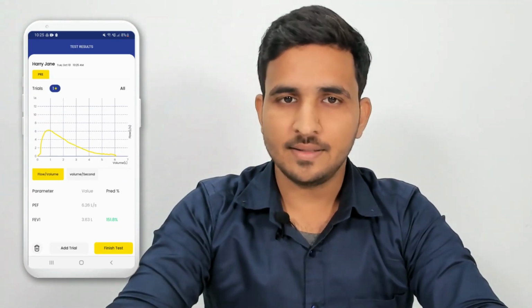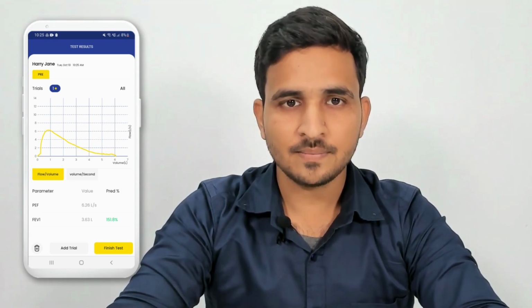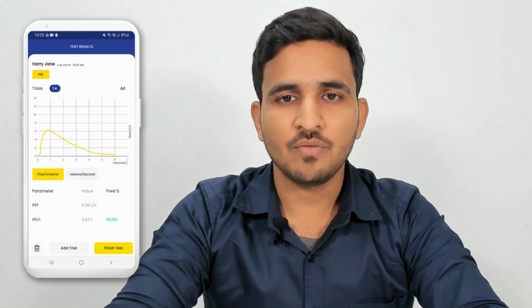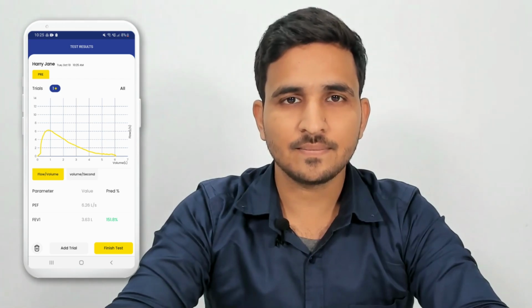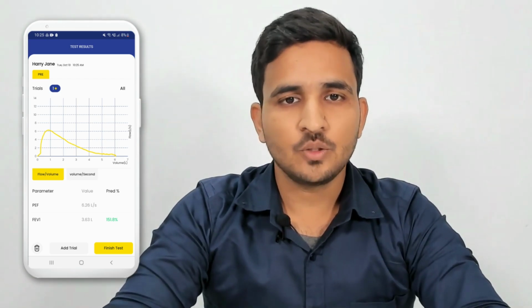This is our trial result with various graphs along with the required parameters. You can add unlimited number of trials by following the same instructions. Now click on the Finish Test to save the results.